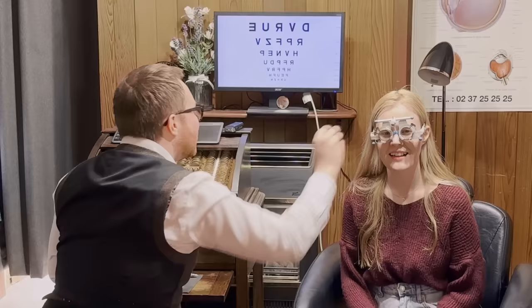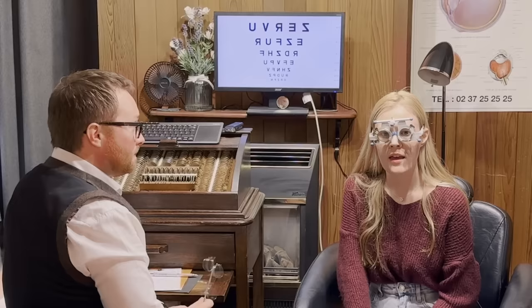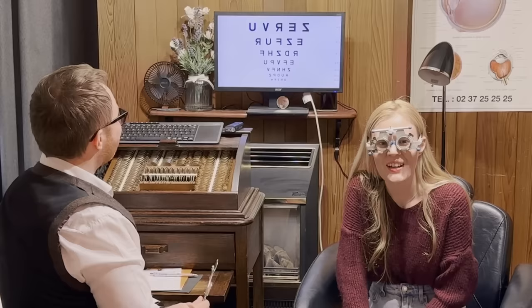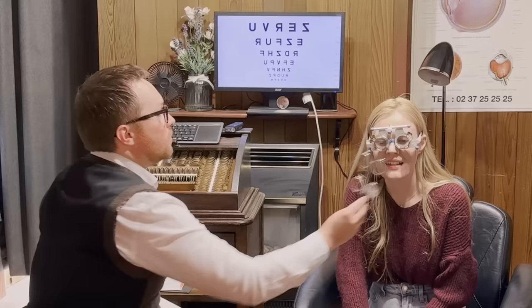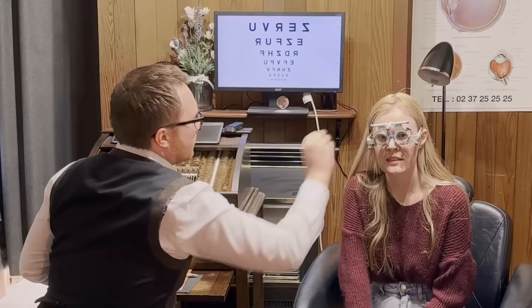And just letters. What's the smallest you can get there? Yeah, you can try the bottom. Okay, yeah. Oh, that's too confident. Don't worry. Do the one above, that's fine. R-U-D-P-Z. Fantastic. So that R-U-D line, is it clearer with this one? Is it a little bit worse or about the same? So that's with and that's without. Worse with. So if we get rid of that blurry one, have a few blinks.